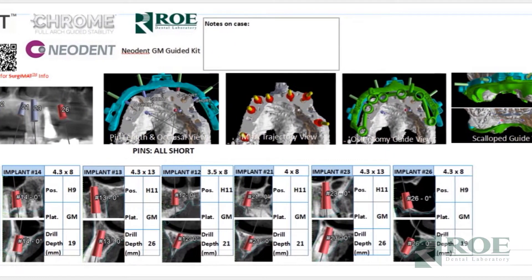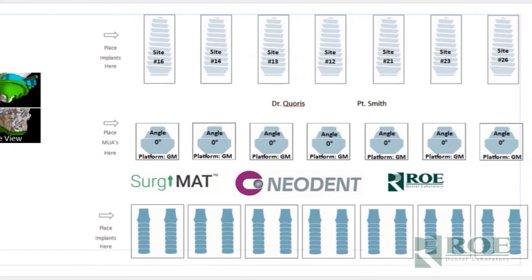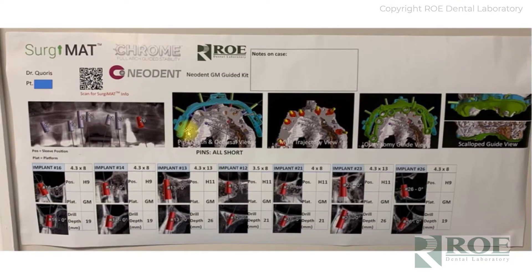We print the surgery mat and place it on the counter in the surgical suite. The doctor will place their implants — number 16, 14, 13 — place the implant here, place the abutment here, and then place two sets of temporary cylinders. It's roughly 25 inches wide by 12 inches tall and is a tool for organizing the case, making it very simple instead of sorting through a big tray full of parts during surgery.